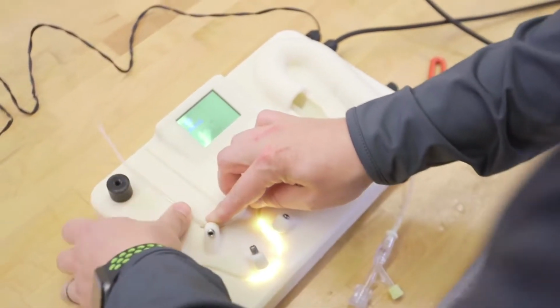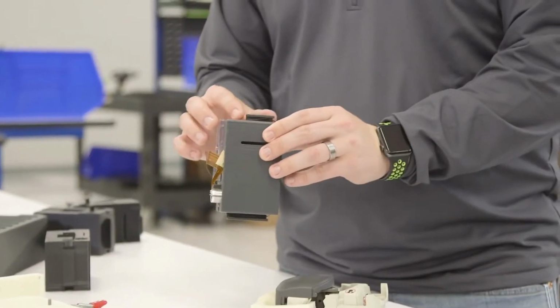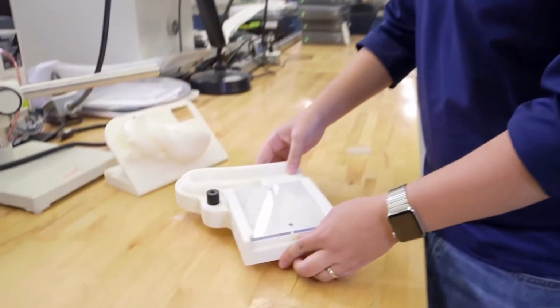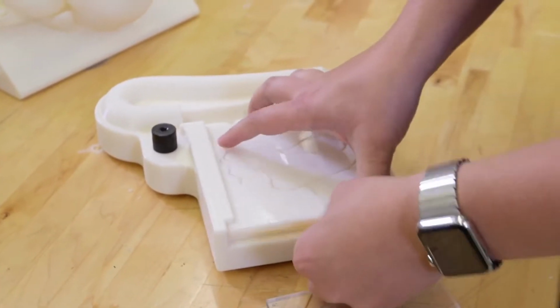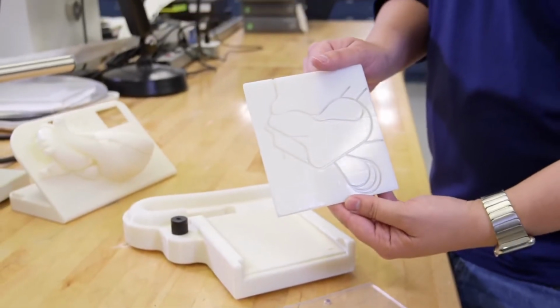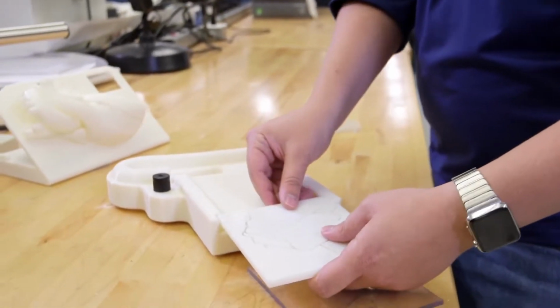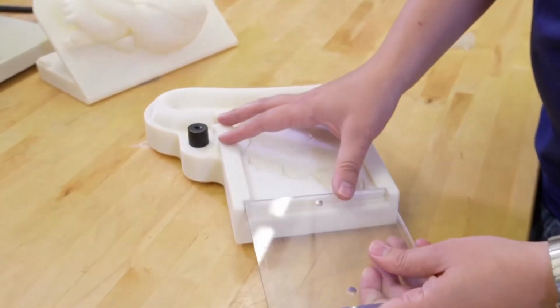3D printing has given us the versatility to print pretty much whatever we can think of. We started 3D printing these coronary training boards. Every single one of our sales training reps that goes through coronary training was actually delivered one of those. They use those to interact with the circulating nurses, techs, physicians at their own sites and train them on proper treatment technique related to our IFU, our instructions for use.